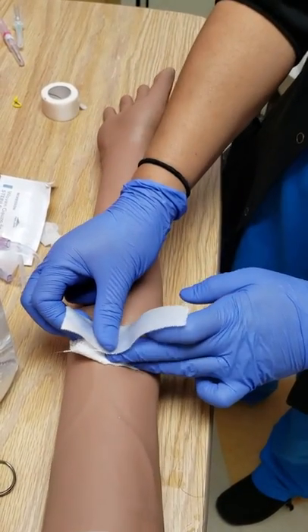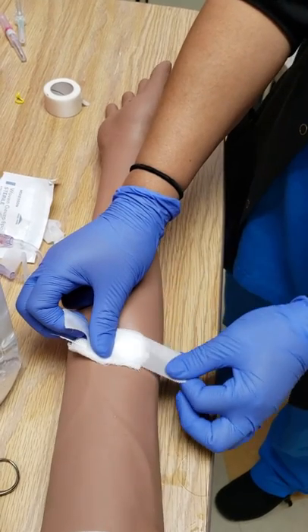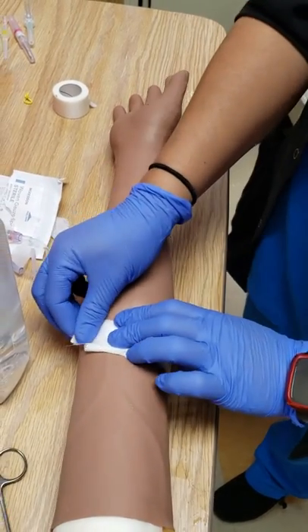You can use this to put gentle pressure on there as well — put that on there and make it tight.